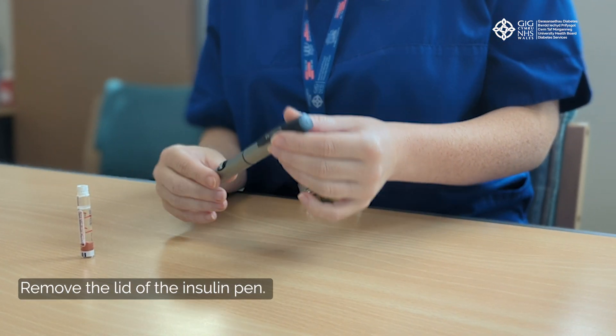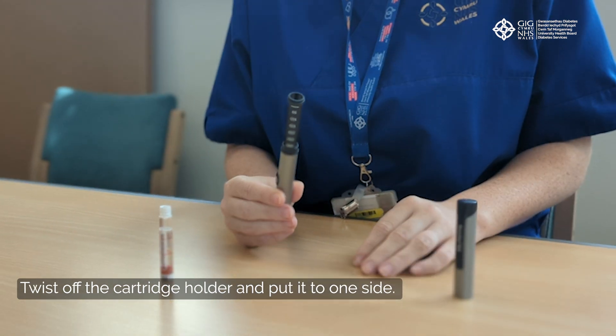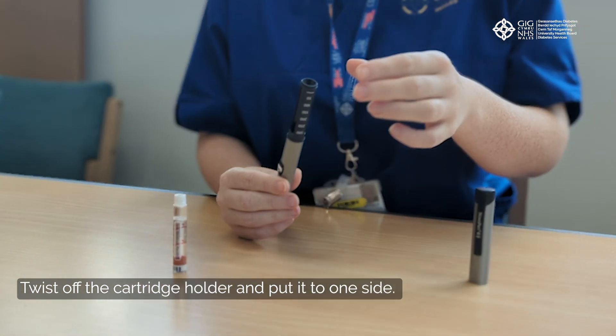Remove the lid of the insulin pen. Twist off the cartridge holder and put it to one side.